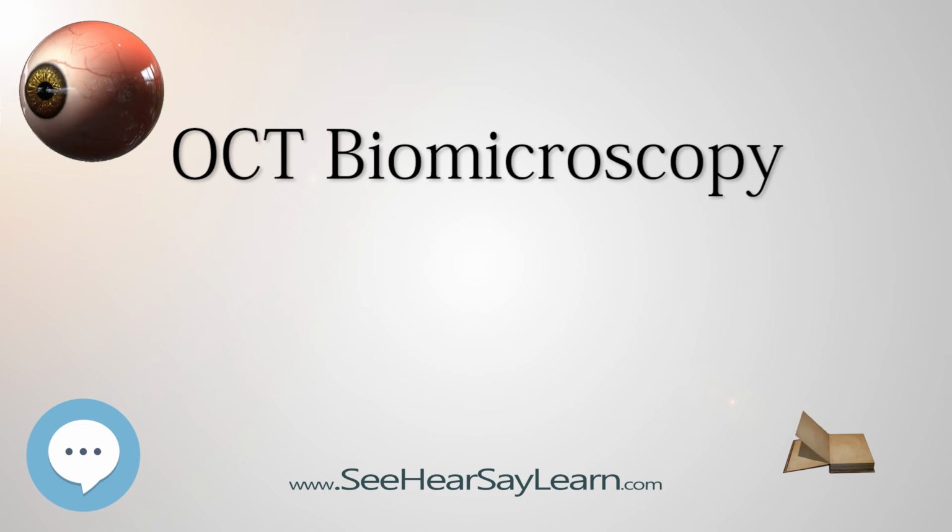Cornea. In addition to recent work with SS-OCT, et al, numerous investigators have demonstrated the ability of OCT systems to depict pathology within the cornea as well as disorders of corneal topography.